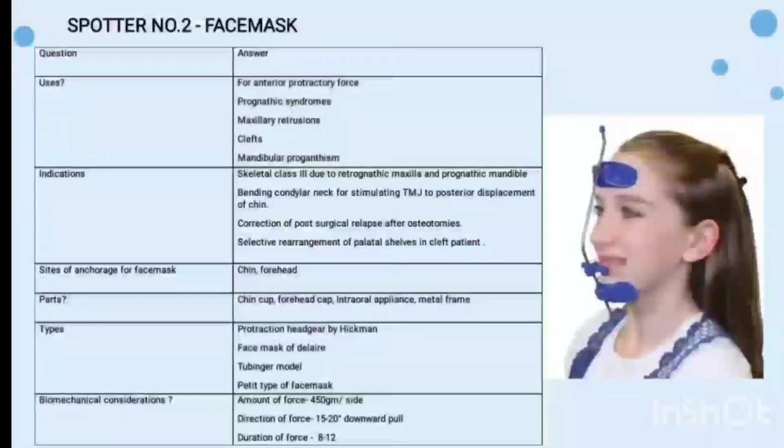First, the amount of force that is required is 450 gram per side. Second, the direction of force, that is 15 to 20 degree towards a downward pull, and the duration of force, that is 8 to 12 hours.